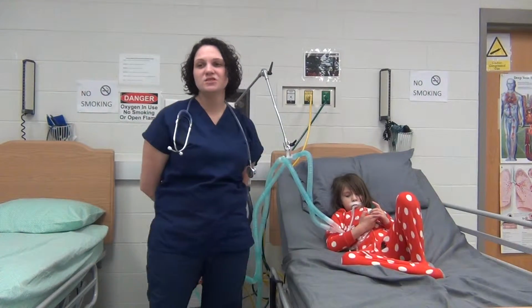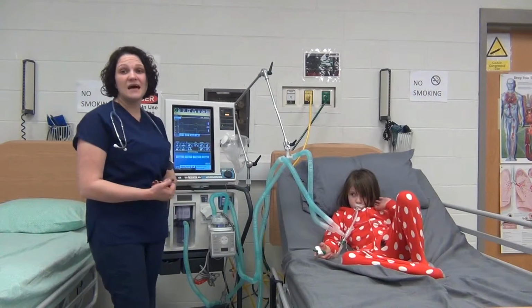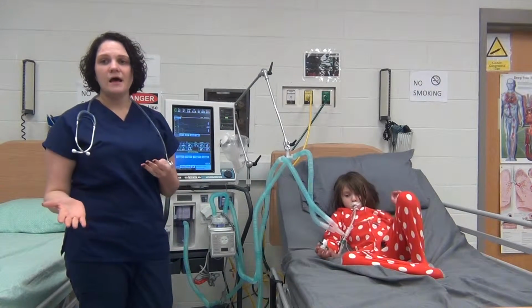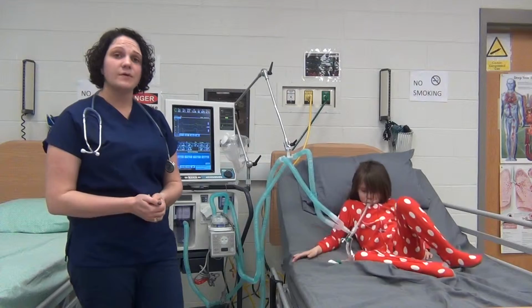I would perform these changes to her rate by decreasing her rate 2 breaths at a time, and then I would wait about 30 minutes in between each increment of 2 I drop down, just to see how Mrs. Tubbs is tolerating and make sure everything's going to plan.